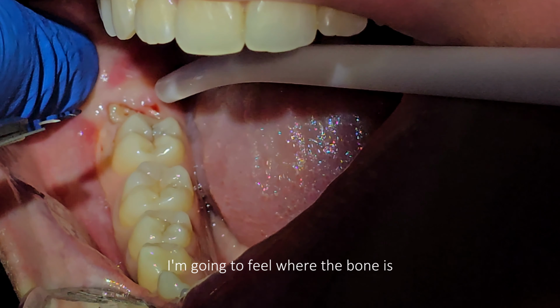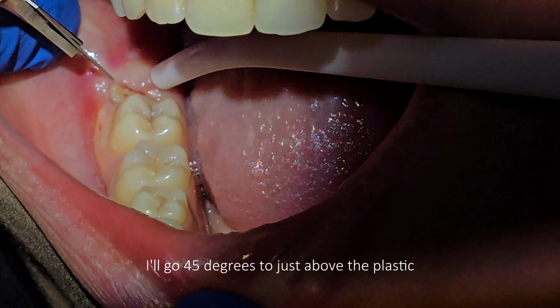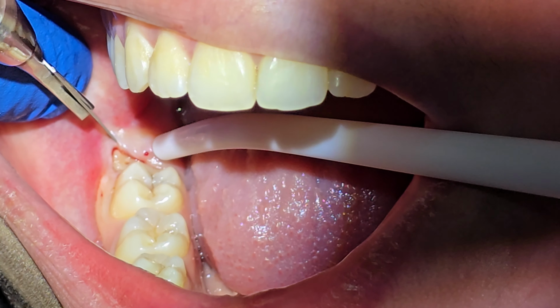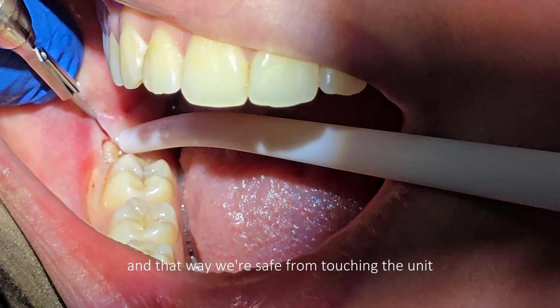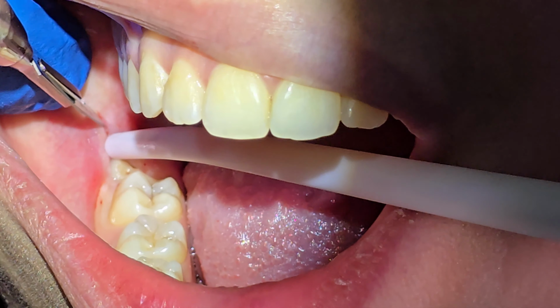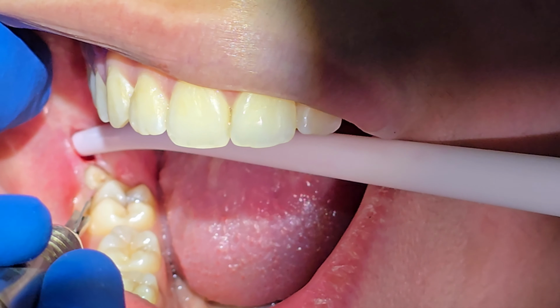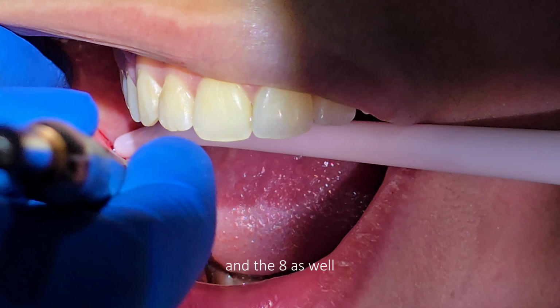I'm going to feel where the bone is and make sure my incision's on bone. Generally, as a rule, I'll go 45 degrees to the distal buccal cusp of where the tooth is going to be. And that way we're safe from touching the nerve. So it will be on bone all the way down. And then we can release the papilla between the 7 and the 8 as well.